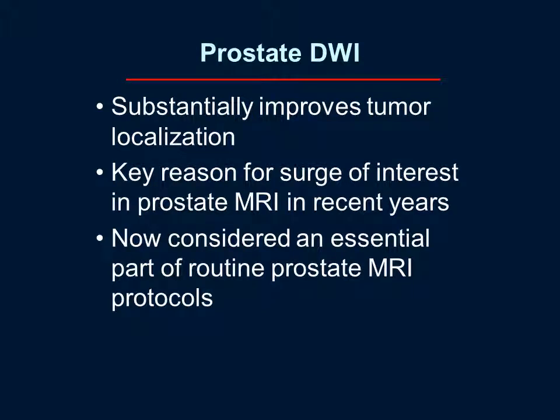So the performance of prostate MRI for tumor detection can be improved greatly by the inclusion of diffusion weighted imaging, which substantially improves the reliability of interpretations. And it's been the real advent and emergence of prostate diffusion that has to be considered a key reason for the surge of interest in clinical adoption of prostate MRI in recent years. And this is now considered an essential part of routine prostate MRI protocols.